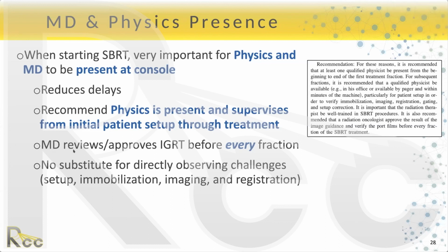Also, the physician should really review and approve those images before every fraction. This is SBRT. We're giving high doses at each fraction. And so before each fraction, you really want at minimum a physician to review those image alignments, ideally physician and physics when starting out.